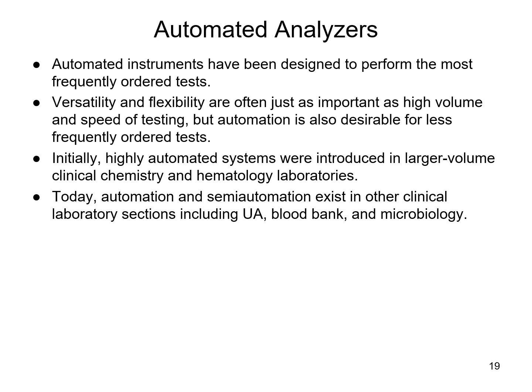Microbiology and blood bank, still a lot of manual testing done in these areas, but there is a lot of automation coming into both of those areas now. And you'll get to hopefully see some of this once you actually get into your laboratory settings.